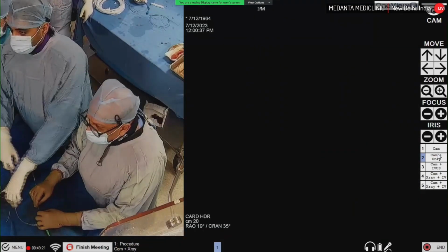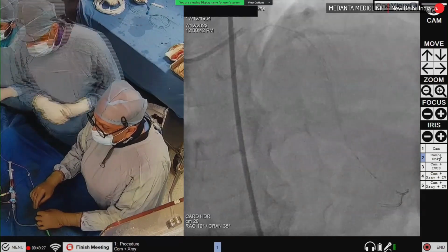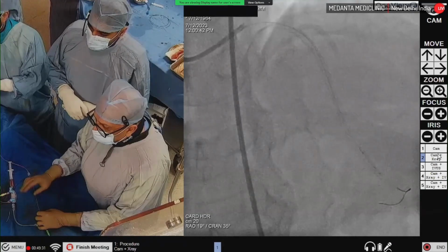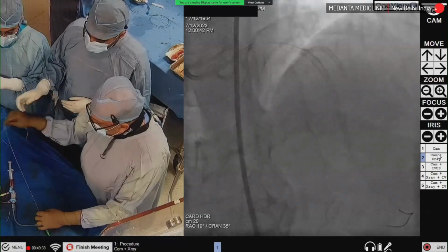Check please. I think this looks nice. Go up. 1, 2, 3, 4, 5, 6, 7, 8. Deflate. So this is a 15? 10, 12. 12.